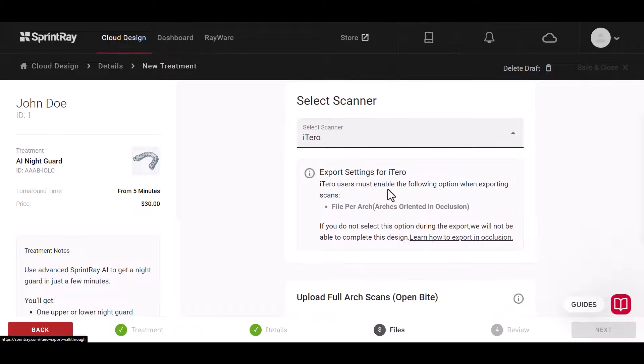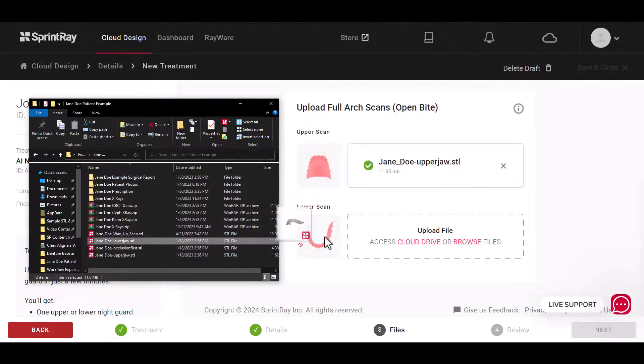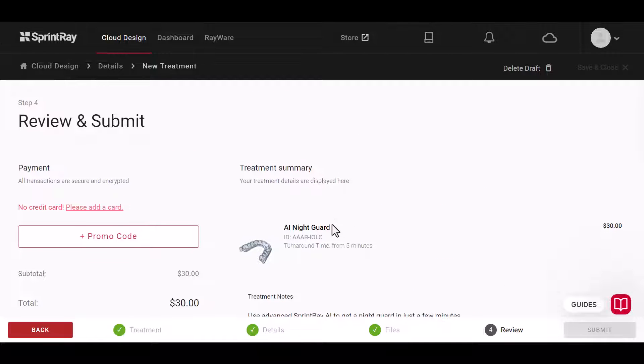After selecting your scanner, upload your files for the upper and lower arch using either cloud drive or dragging and dropping from your local storage. Once complete, submit the request. You'll get an email in a few minutes when the design is ready.